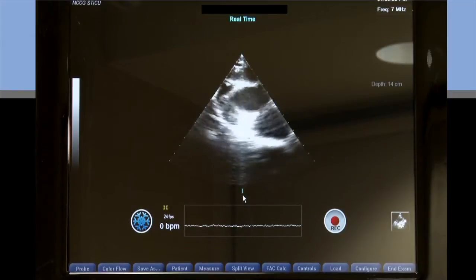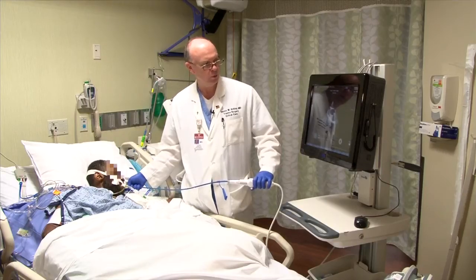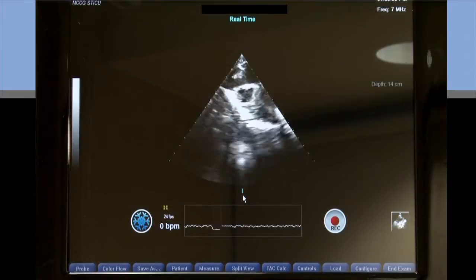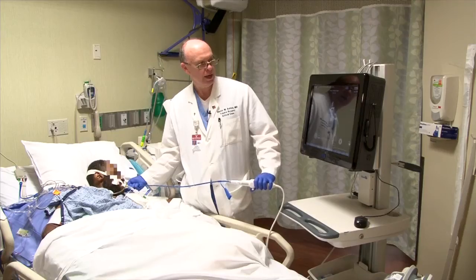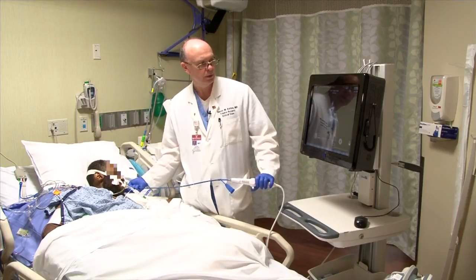I can start to see the SVC coming into play, but it's not in the center of the field. So again I'm going to rotate clockwise here and bring that SVC into the middle of the field. Now you can see a nice round structure — the SVC — with a white dot, or artifact, in the SVC, and that's our central line. Now that I have it in good position and a good view of the SVC, it's in the middle of the screen.